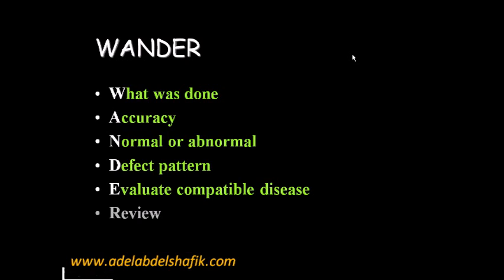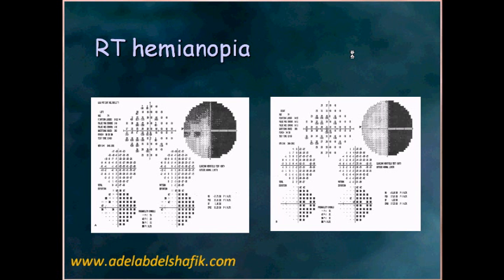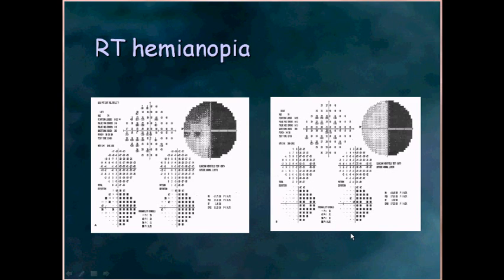Now we come to the pattern of what we see — what goes with any particular disease. For example, here you get affection in this eye. As you can see, it's a real local change. It's not a media opacity compared also to the second eye. This pattern respects the vertical, so it's a neurological defect. It's a hemianopia — we can make this diagnosis.